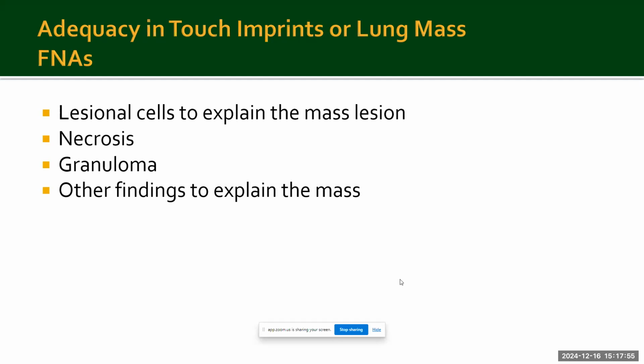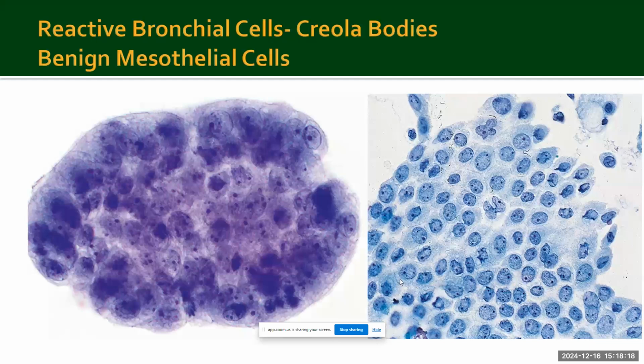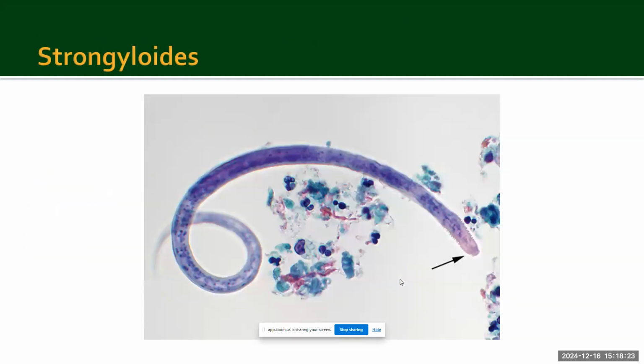Exactly. This is a very huge and broad topic, and often helpful for the clinician because the microbial studies, especially the culture studies or the immunostains, everything takes a while to come back. So even if we can hint what we are seeing, it helps a lot for the clinicians to come to a diagnosis. So I will be talking about a few infective conditions here.